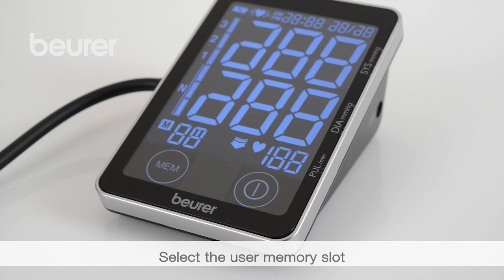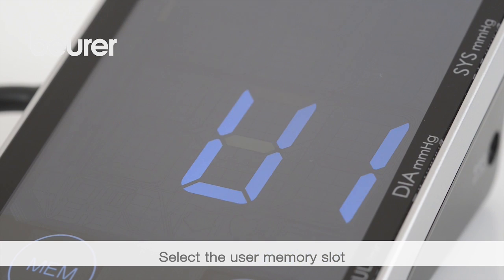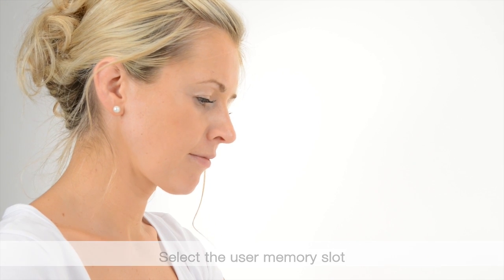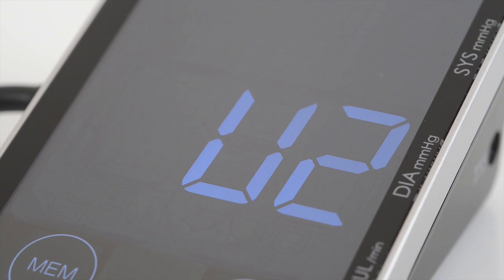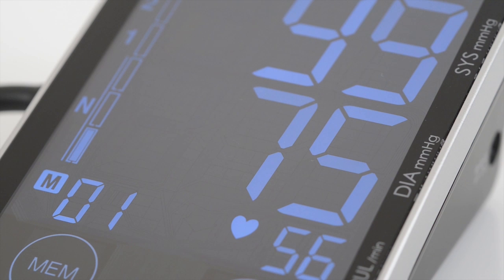All displays will illuminate briefly and the user memory U1 or U2 used most recently appears. To change the memory, press MEM, then press start stop to confirm your selection. The last stored value is displayed.